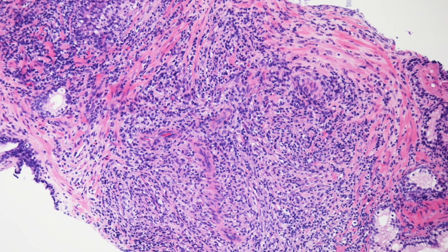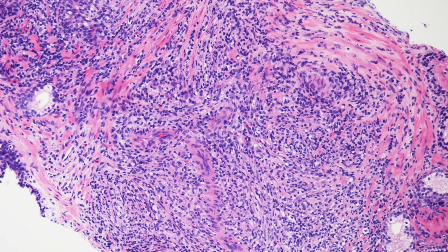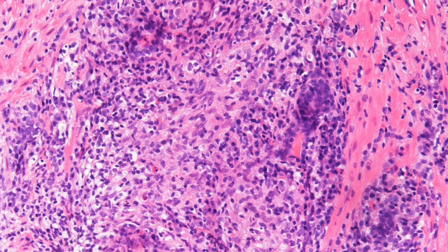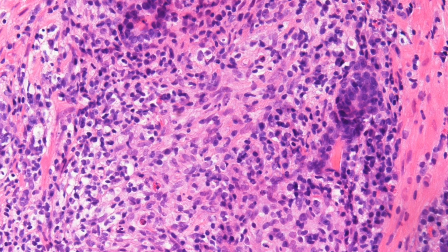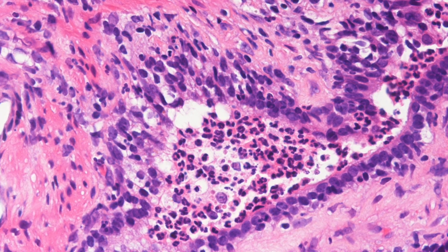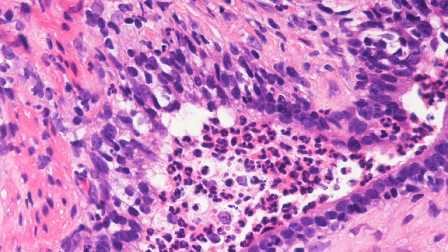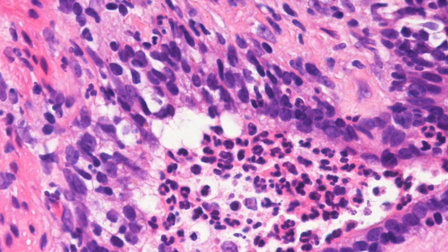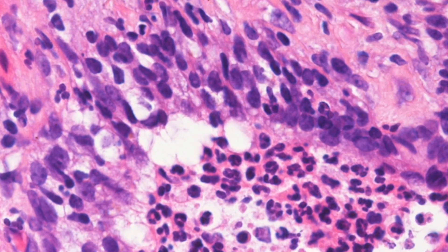On low power the granulomatous prostatitis has a rather nodular appearance — the nodules are the granulomatous inflammatory infiltrate. Higher power reveals the cells to be histiocytes and lymphocytes with maybe a few polymorphs. And elsewhere there may be active prostatitis; here you can see a duct containing neutrophil polymorphs with damaged epithelium, which results in the granulomatous inflammatory infiltrate forming around the duct.